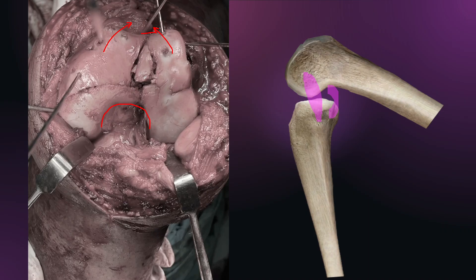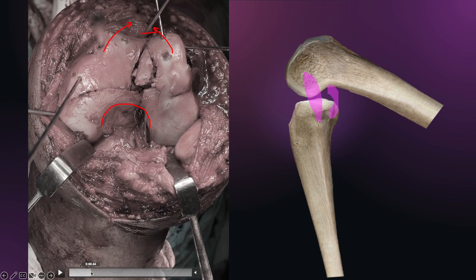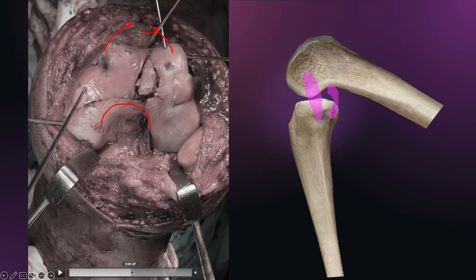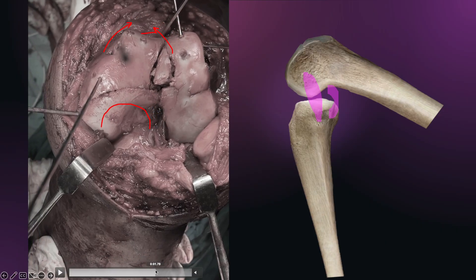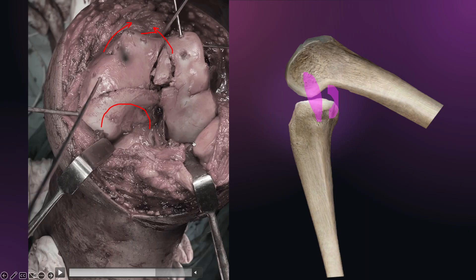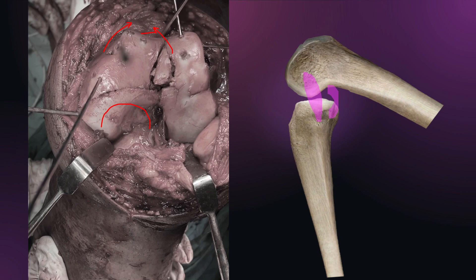A large fragment can definitely be placed and stabilized with a screw — independent of the plate or passing through the plate. You can remove extra fragments or just bury them inside the bone. The articular exposure is good, and we are simply retracting the patella to expose the whole medial as well as lateral condyles. These two simple maneuvers — lifting the femur up and doing the anterior drawer — can definitely help in reduction of the Hoffa fragment and in extensive exposure for the posterior part of the condyles. If you want more exposure to place screws from posterior to anterior, you can flex the knee further after securing reduction with multiple K-wires. I tend to use 2.5 mm K-wires — they are rigid and have good stability.